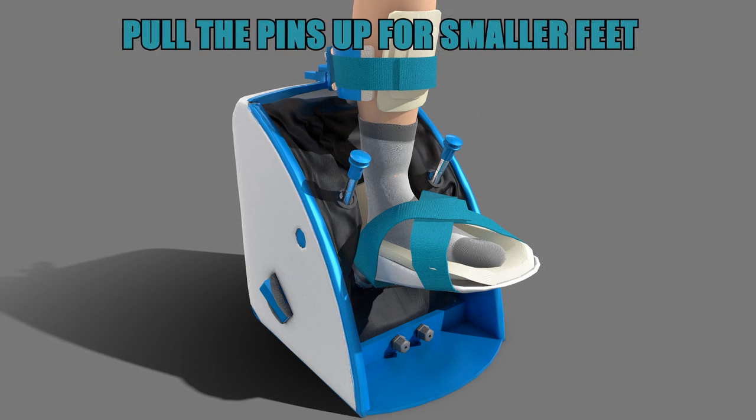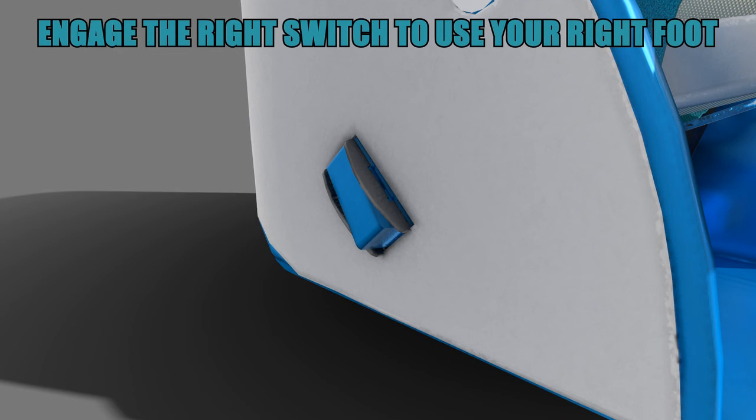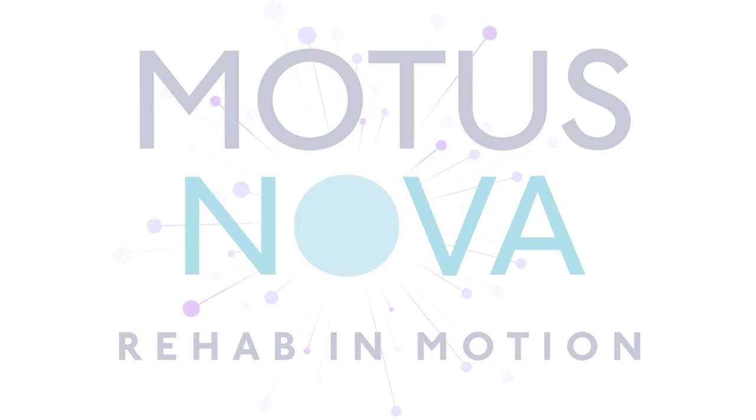Press in for large feet and pull up. If you are using your right foot, you will press in the right side selector switch to make sure that your foot is moving smoothly along the axis of rotation. If you are using your left foot, you will press the left side selector. You are now ready to use the foot mentor.